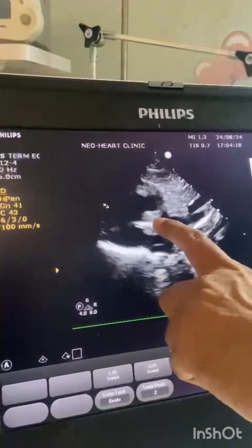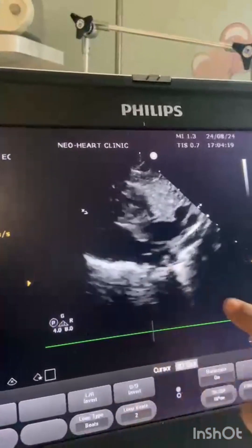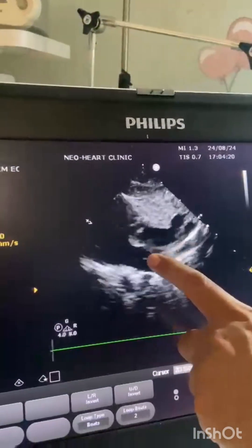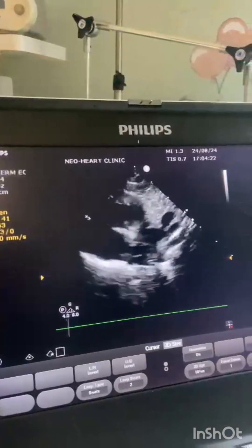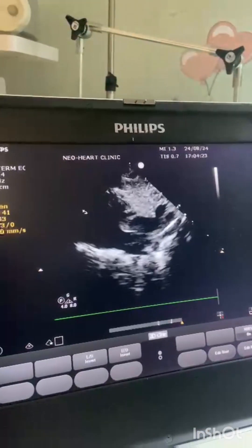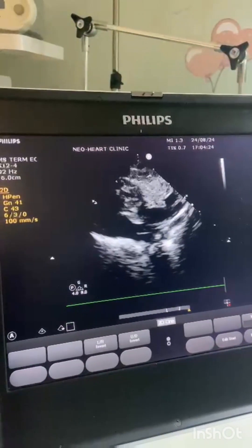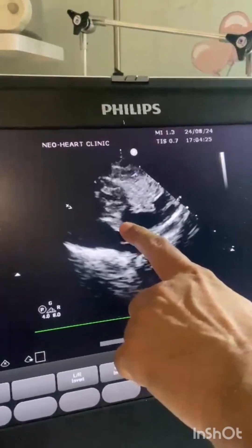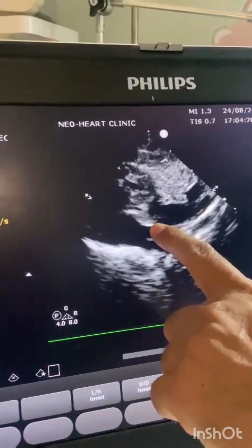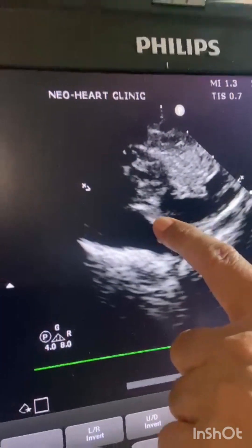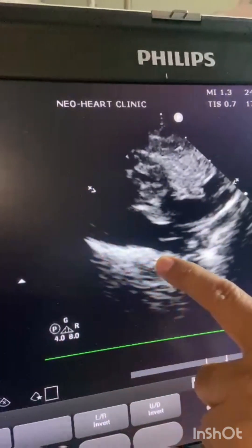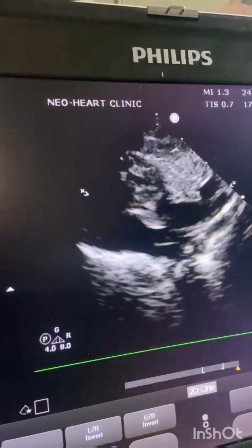This is the SVC entering into the RA, and here we will take the diameter of the SVC — just before when it enters the right atrium.